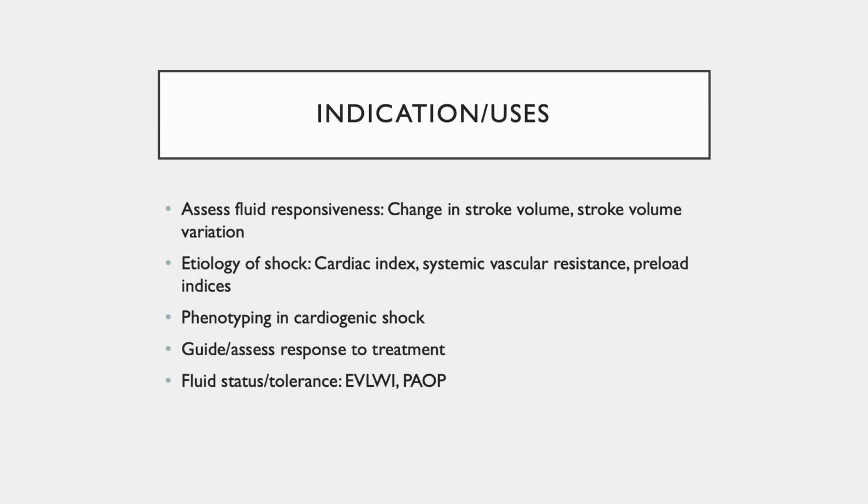Indications and use cases of cardiac output monitors include the following. Firstly, assessment of fluid responsiveness, where changes in stroke volume or certain measures like stroke volume variation can be used to assess fluid responsiveness.